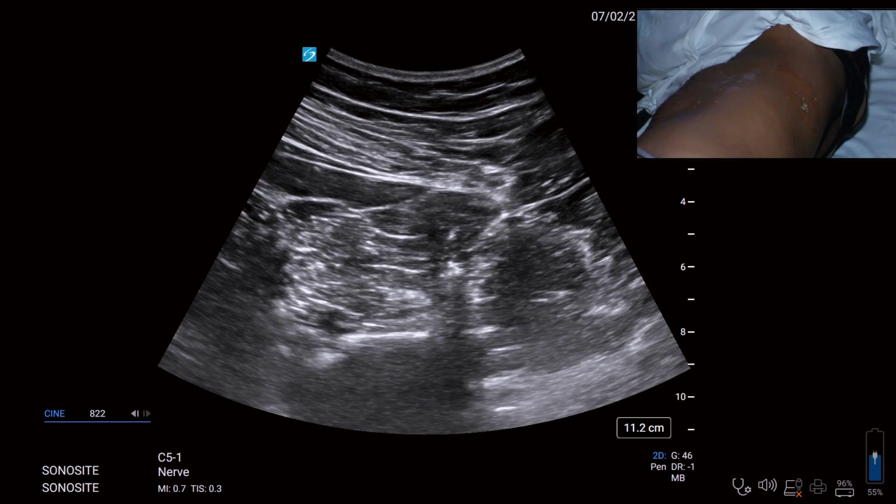We give 25 to 30 ml of 0.3% ropivacaine with dexamethasone. If I have to give bilateral blocks, as we do for TLH, we add 5 microgram per ml of adrenaline. On the posterior surface, there are certain vessels. First, switch on the color so that you do not go accidentally wrong. If I get my drug here, this is lateral QL. If I get my drug here, this is posterior QL. If I get my drug here, this is anterior QL. Is the concept of quadratus lumborum block clear?